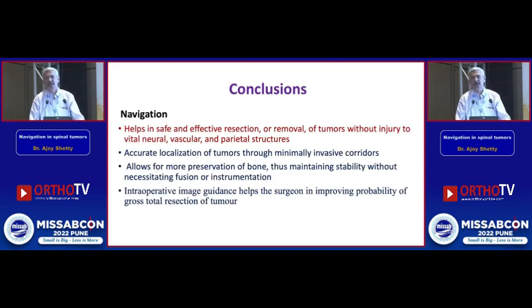To conclude, navigation is an important tool. It helps in the management of benign tumors to help us to localize and excise the tumor, and by doing intraoperative navigation, we can avoid the chances of doing an incomplete removal. Whereas in aggressive and malignant tumors, it helps us to plan the tumor margins, safe resection, a wider resection, and a tumor-free negative resection.